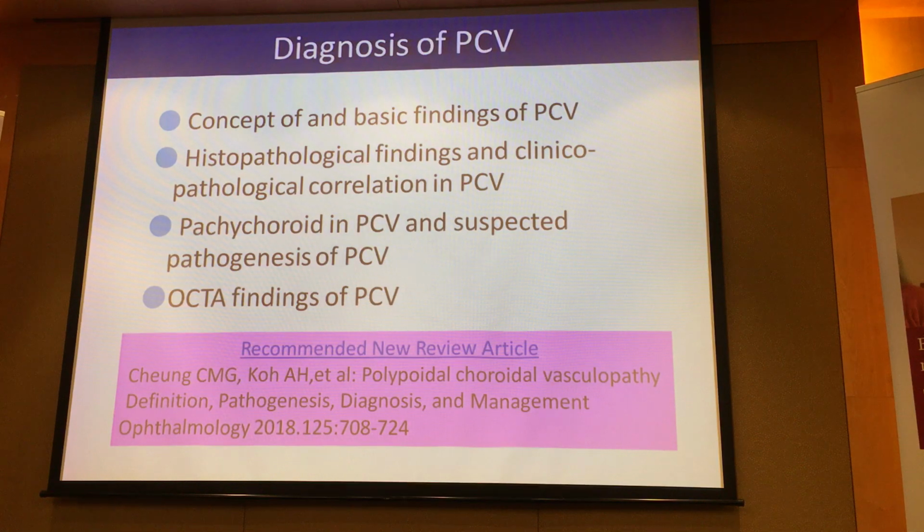We use manual segmentation to see the best figure of the blood vessel. We think that this is reliable data. I understand, but would you expect to see less red in the flow when the BVN and the polyps regress, because it wasn't demonstrated in the slide that you showed us?